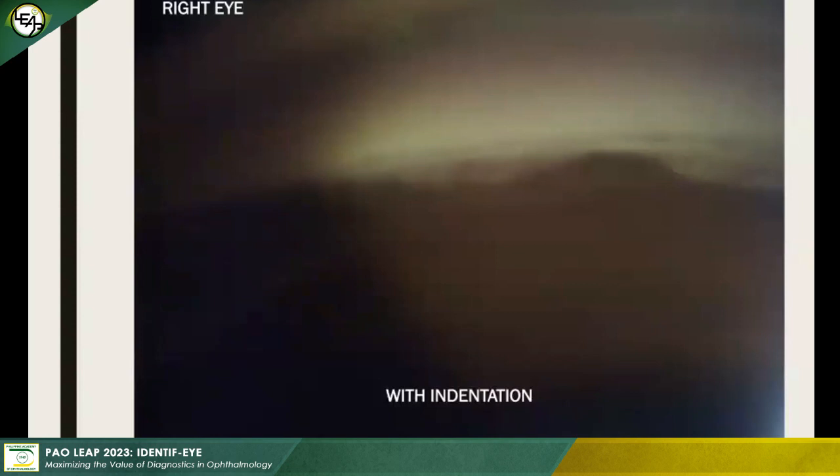And then at the 7 o'clock hour, there's this very broad sheet of iris adherent to your angles. On indentation, the broad sheets are seen not to move. They're still there. They are persistent. And there's note of wispy webbed vascularizations over the angle. Similar findings were seen on the nasal angle.